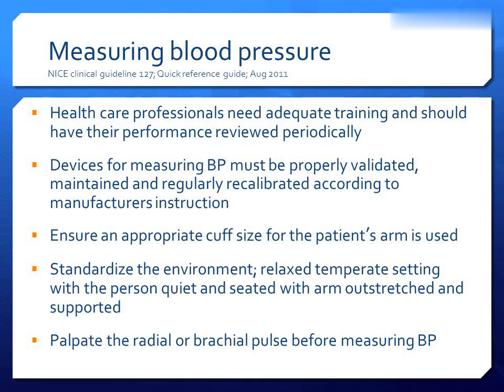Measuring blood pressure. NICE Clinical Guideline 127, Quick Reference Guide, August 2011. Healthcare professionals need adequate training and should have their performance reviewed periodically. Devices for measuring BP must be properly validated, maintained and regularly recalibrated according to manufacturer's instruction. Ensure an appropriate cuff size for the patient's arm is used. Standardize the environment, relaxed temperate setting with the person quiet and seated with arm outstretched and supported.